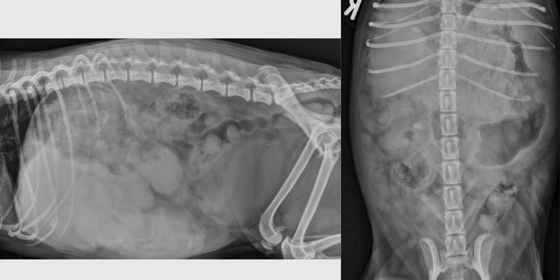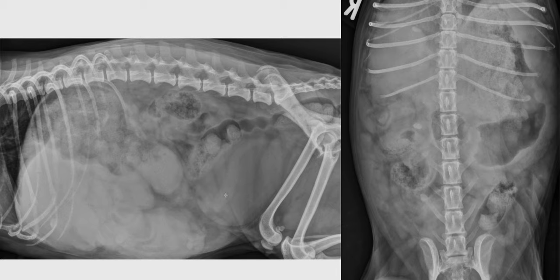An additional finding in this radiograph is that we can slightly see the uterus, which is not often the case. When we see it, it could indicate a mild enlargement — that could still be physiological because it's quite mild, like a recent estrus, but we could also consider an early pyometra or mucometra. The stomach is also quite filled with mottled content, most likely food, but there is also a bit of mineralized content which could represent a small piece of bone or a small foreign body.